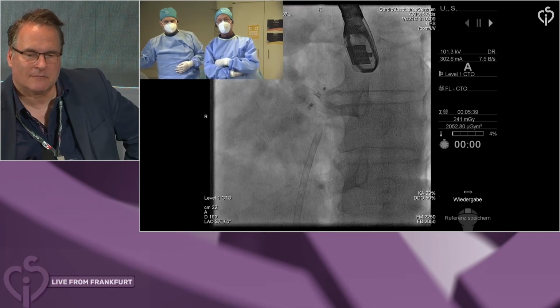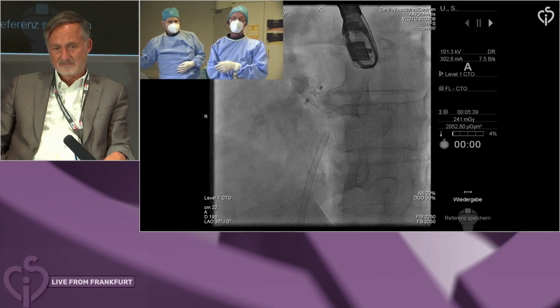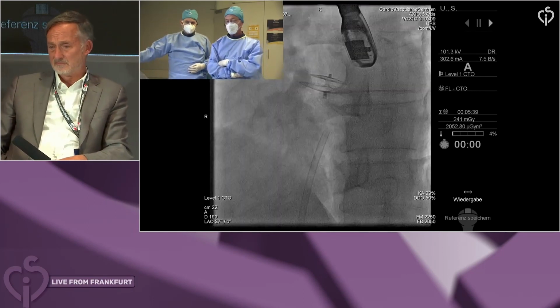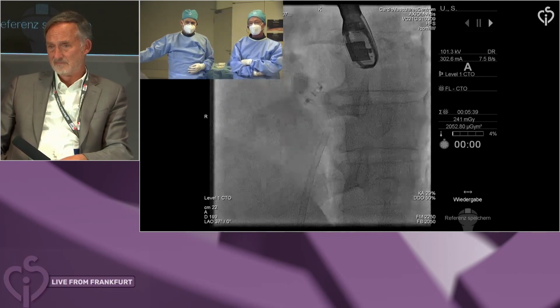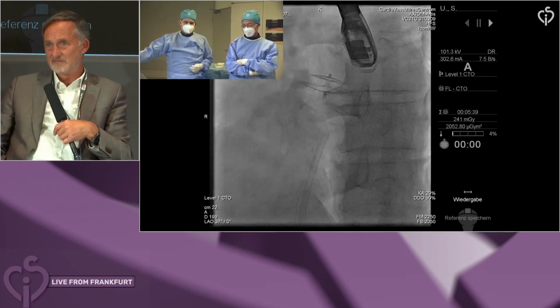In that particular patient, the nurse, who collapsed on my round, I did pericardiocentesis the entire night, retransfused a lot of blood, and then I sent her to surgery the next morning. So I always try to stabilize the patient, and sometimes it closes off and heals, and sometimes not. So that's my strategy in these situations.